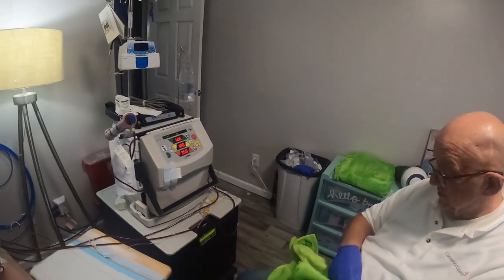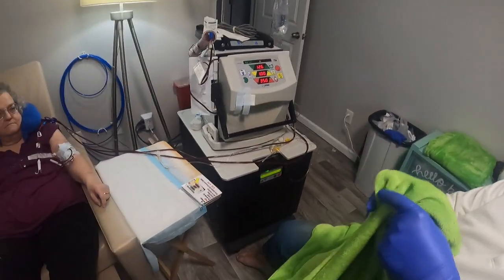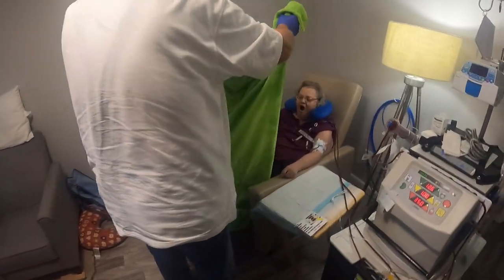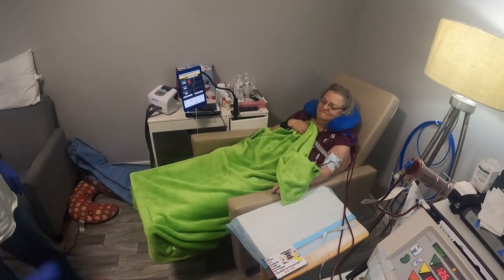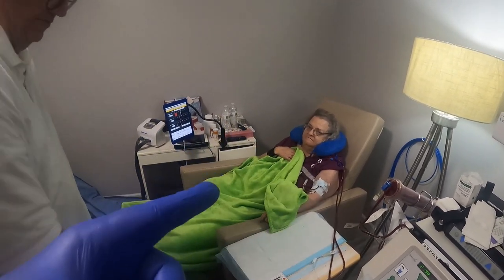And that's what the blanket's for. I always try to put the blanket in the same place every time, so that if we picked anything up off the floor, it's always at the same end of the blanket. And this is important for customer care. And comfort, because the body's working hard right now. We talked about this yesterday.